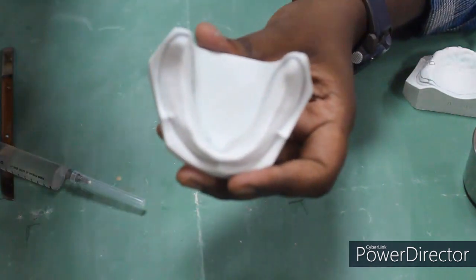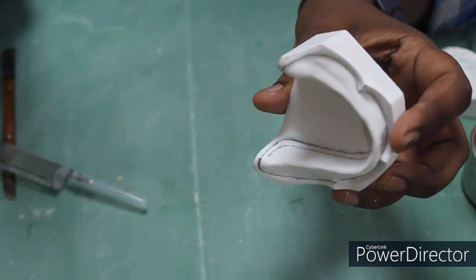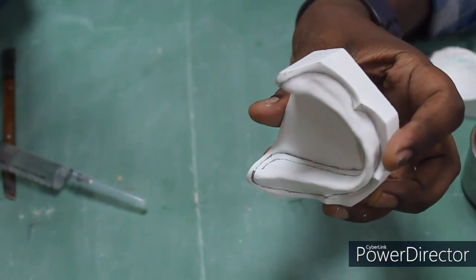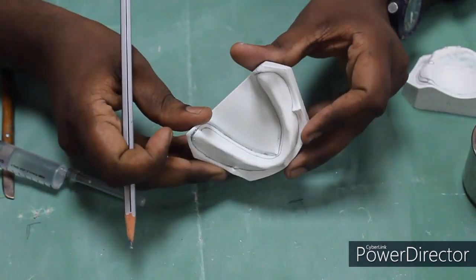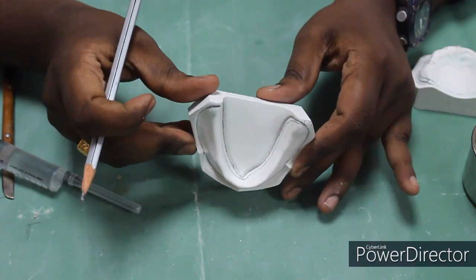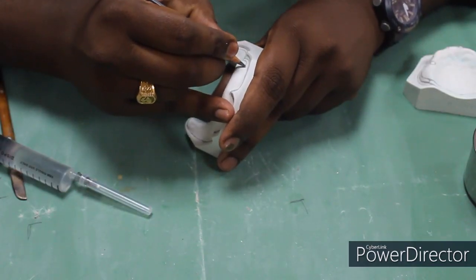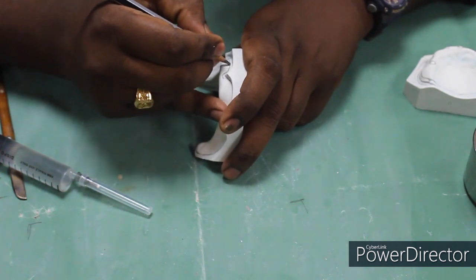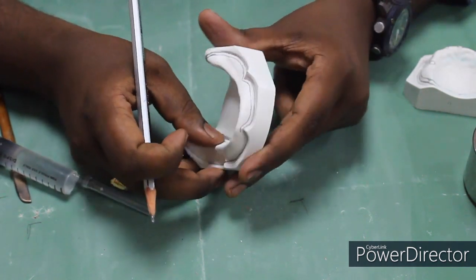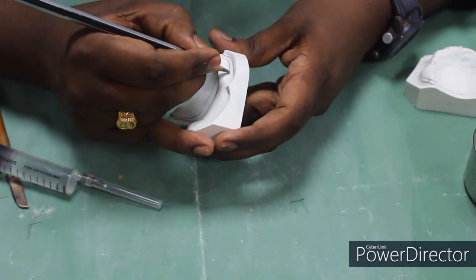In the lingual region, I have drawn this second line. Now you can visualize it. It will be 2 mm short from the depth of sulcus. I am going to continue this second line to the labial aspect and the buccal aspect. I am continuing on the buccal and labial, the same way for this side also. It's 2 mm short.